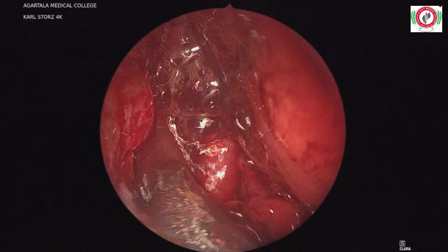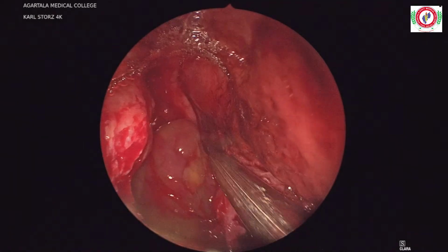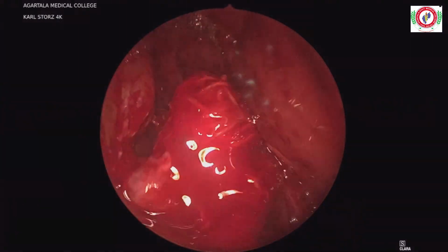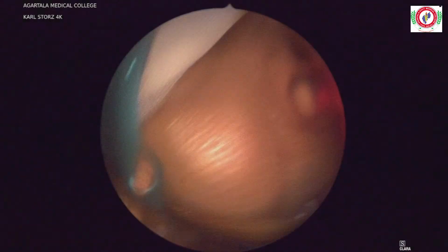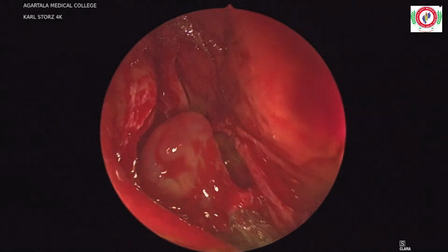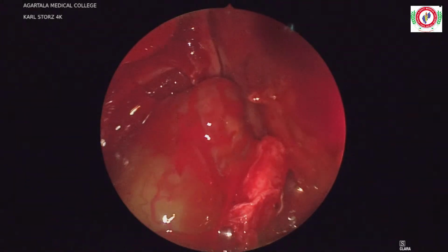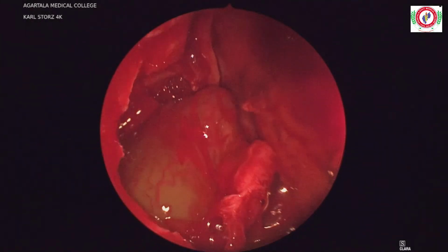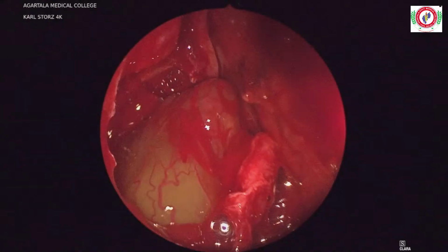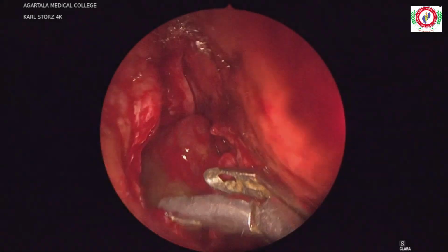Suction. Wash. That's all. Okay, give me upturned forceps.